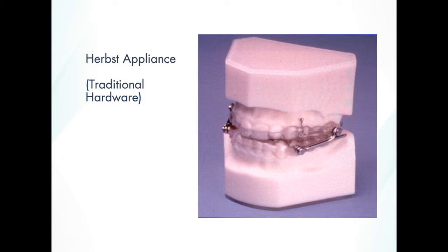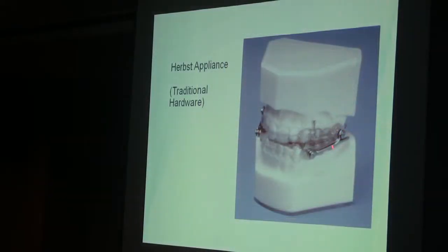It's got a little bar on the side, and it used to be you had to put these little sleeves on, but now we've got a little tool that we can crank it. So that's become a very popular appliance. Somehow Medicare has decided that all oral appliances have to be hinged. This is the only hinged appliance that's out there.